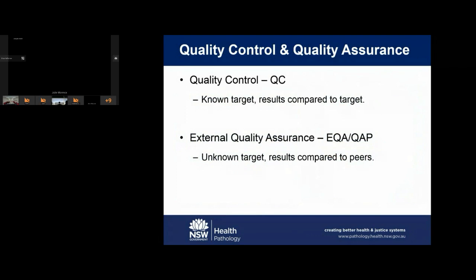Well, we have some quality systems to monitor the procedures and processes, and quality control to make sure the systems, devices, cartridges and operators are all working as they're intended. And I know everybody loves their quality control samples and their quality assurance, which is a check that everybody is able to get a similar result for the same sample in the same test.